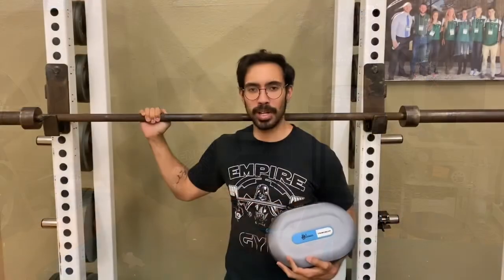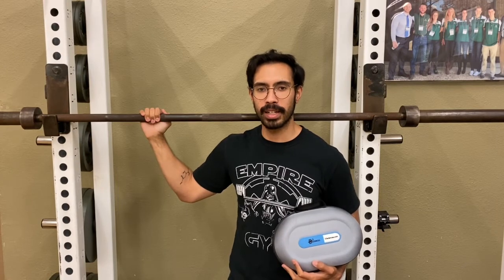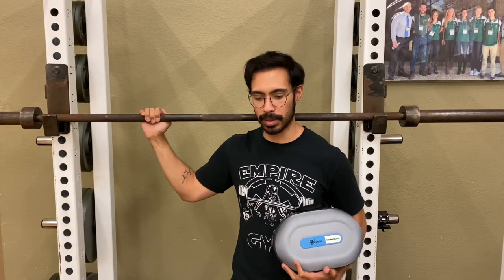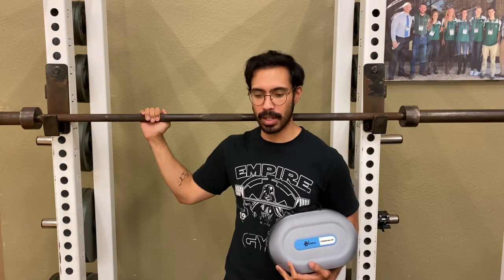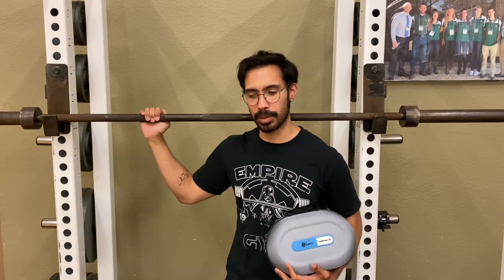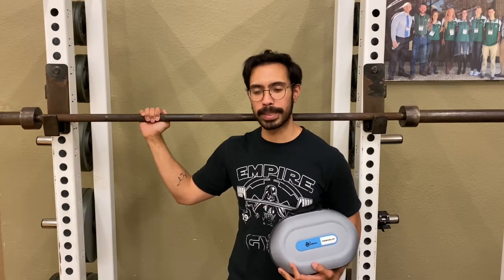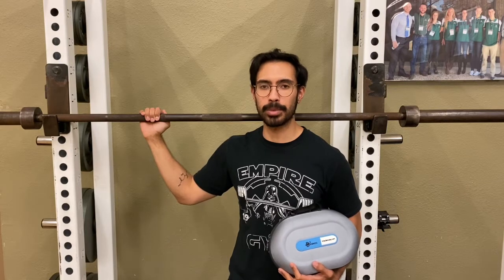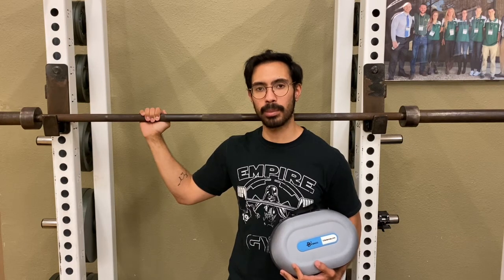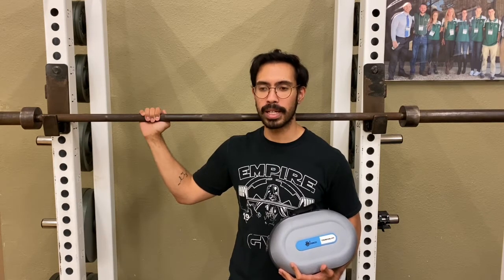Okay. All right, so hopefully you are now just a little bit more equipped on how to utilize BFR safely and effectively. It's really important that we figure out how to standardize BFR as an upcoming ubiquitous practice in training and gym culture in general. And I think that moving forward, we should also try to discourage the use of products that are much less reliable, like knee wraps, things of that nature, where we really can't objectively measure the pressure that's going inside of the cuff. So the ultrasound Doppler is going to be your best bet when it comes to figuring out the most accurate and reliable way to determine arterial occlusion pressure, or AOP.